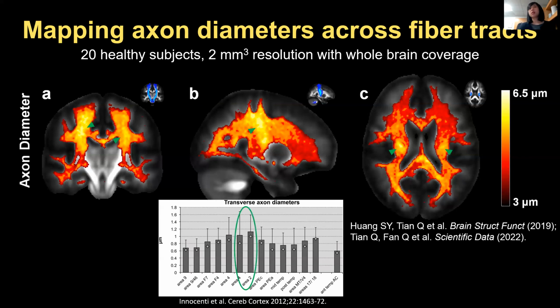And these findings are very much in agreement with what's been shown from axonal tracing, this is a study from non-human primates. It suggests that we're able to capture some feature of the axonal morphology that agrees with what has been seen under the microscope, and that we're sensitizing our diffusion measurements to these very small compartments using the high gradient strengths.